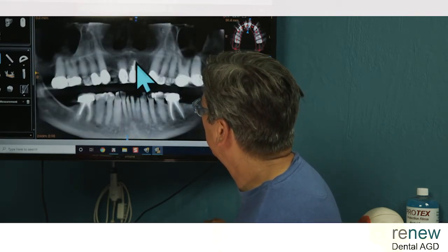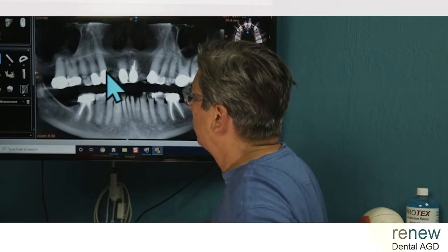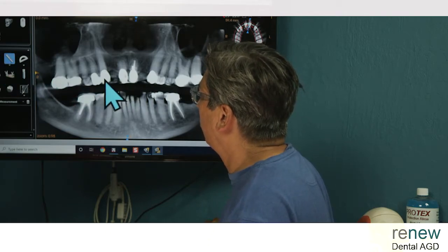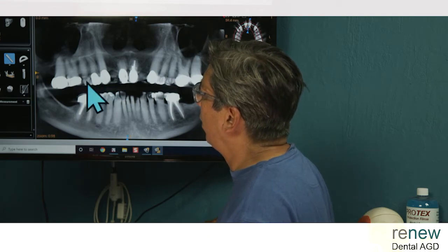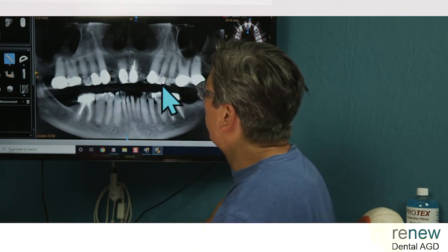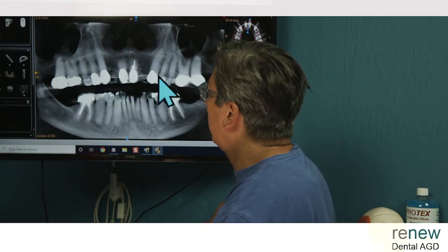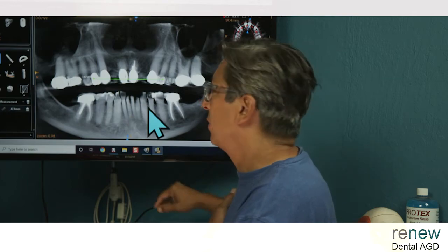If he loses this one, you can do a fixed piece across here. So a 6-unit bridge. These are already splinted. I'm not sure why those are splinted, but it makes me feel like, oh shoot, maybe we should splint another one or double abutment all the way across. So maybe it's an 8-unit bridge if he wants something fixed.